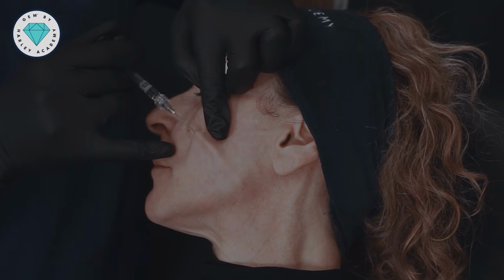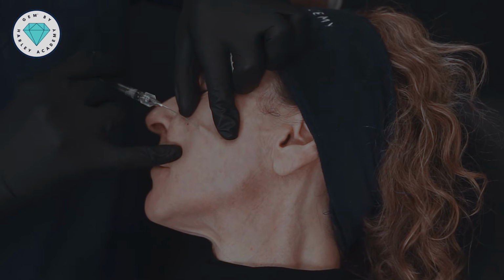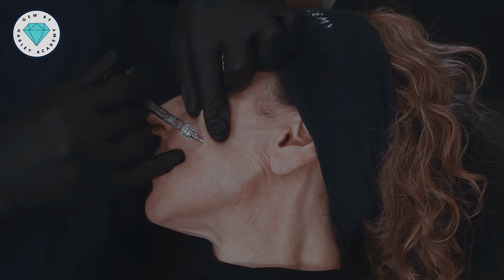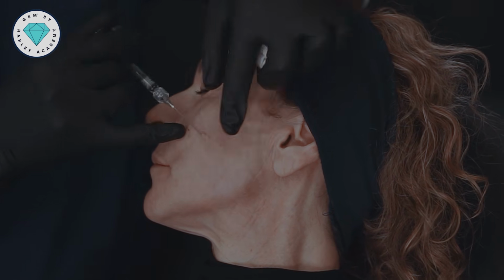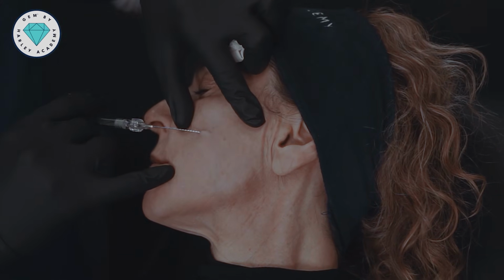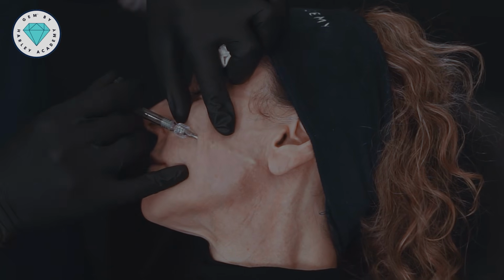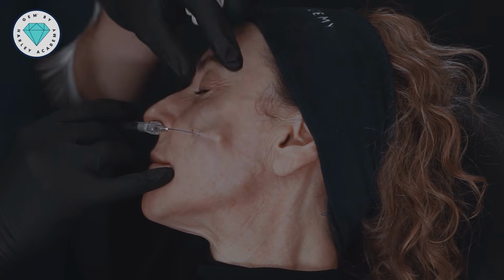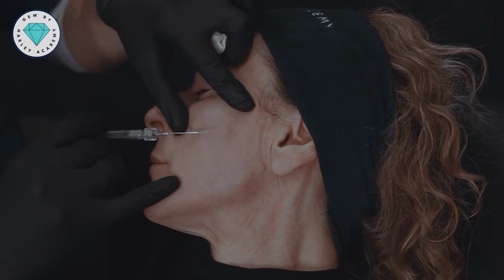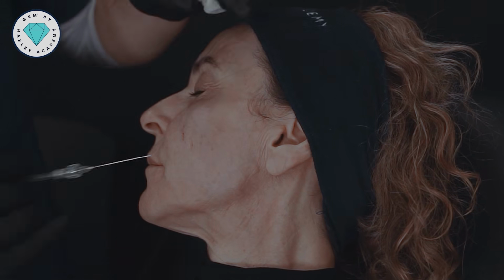What's tempting to do whilst you're doing that is to keep injecting filler as you come all the way back to your entry point, but then you'll end up with a concentrated area right by your entry point where you've deposited lots of filler. So have a point where you're going to stop injecting filler, which for Tristan is about there actually. Stop injecting, come back, reposition. Yeah, so about here, I wouldn't be injecting this little part of the track every single time because, as Max said, it can create a nodule of filler, which we don't want.